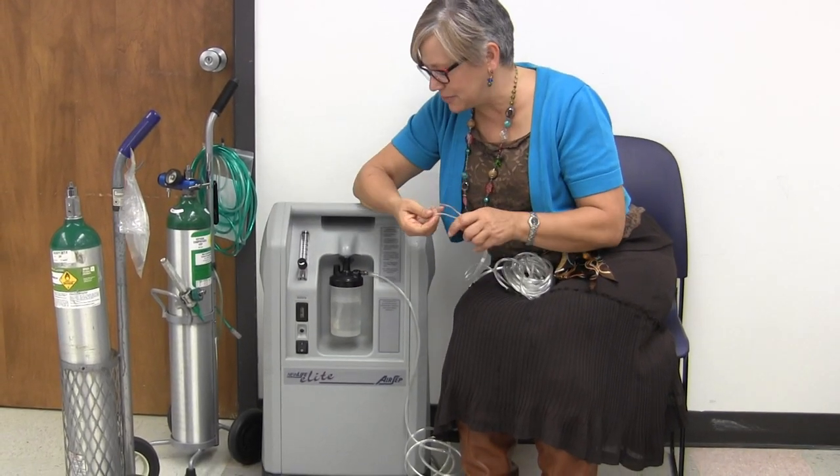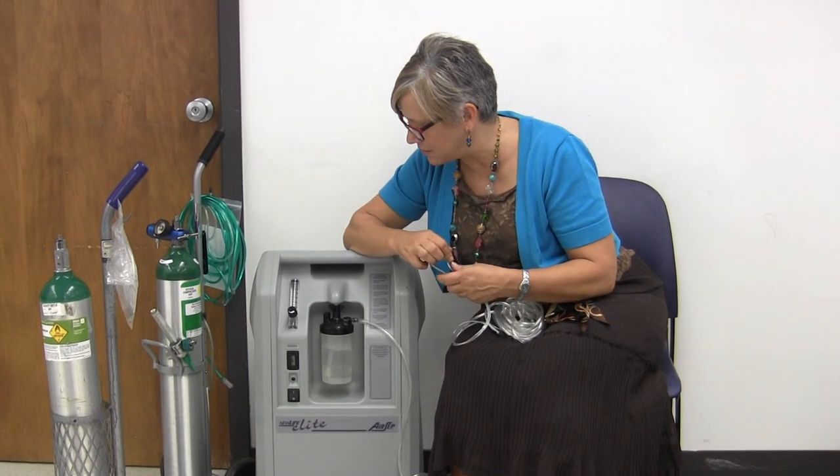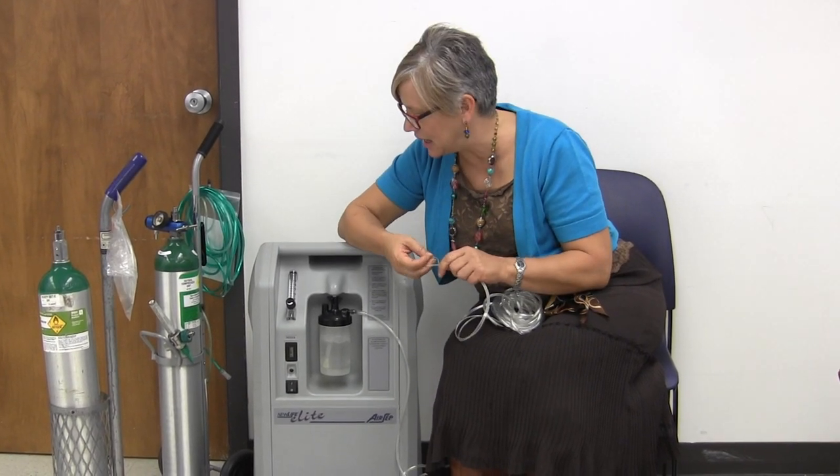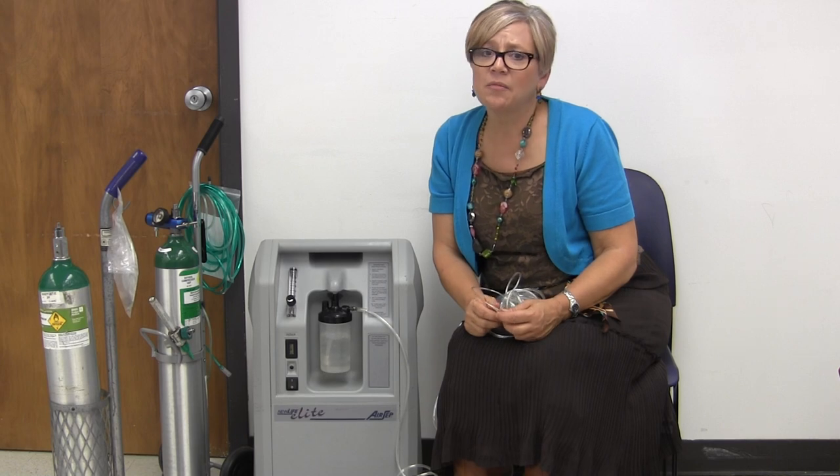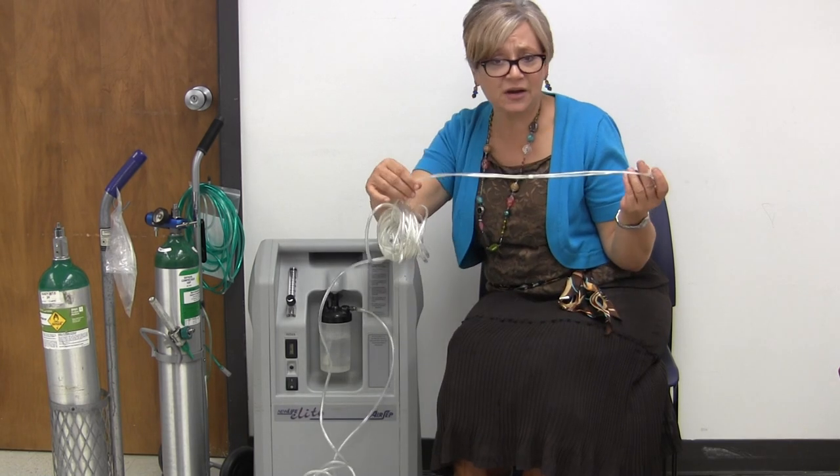Now lots of times you'll have your residents say, 'I'm not getting any air.' And of course we're always thinking, well, they have COPD or something like that. But perhaps you better check first.